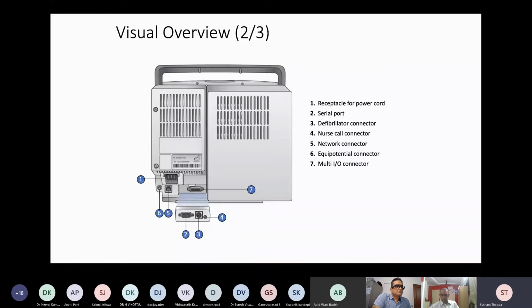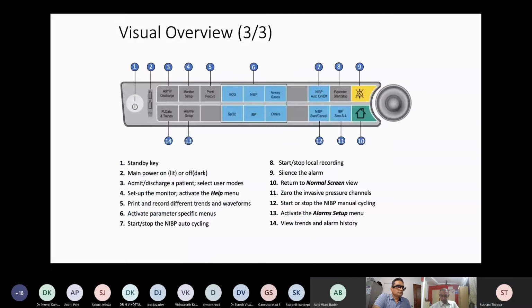And once the network ports are available, there are a lot of options to get the data out and put the patient monitor on network. Why is this important? Because the communication becomes easy and your path to digitization is that much easier. I'll not go into details of what other parameters are there, but the important thing to remember is that there should be network ports so that you can always hook up your monitor to a network.